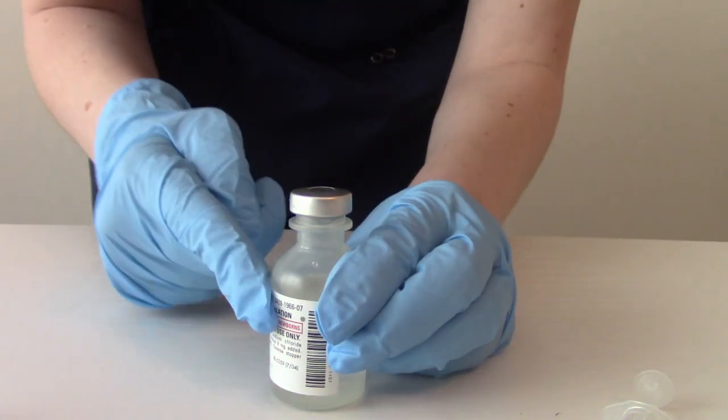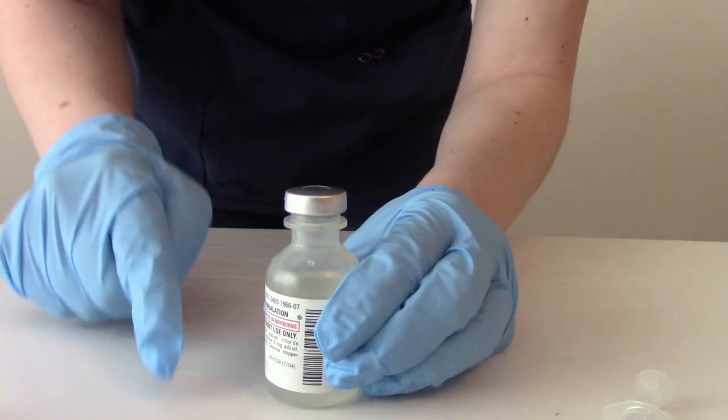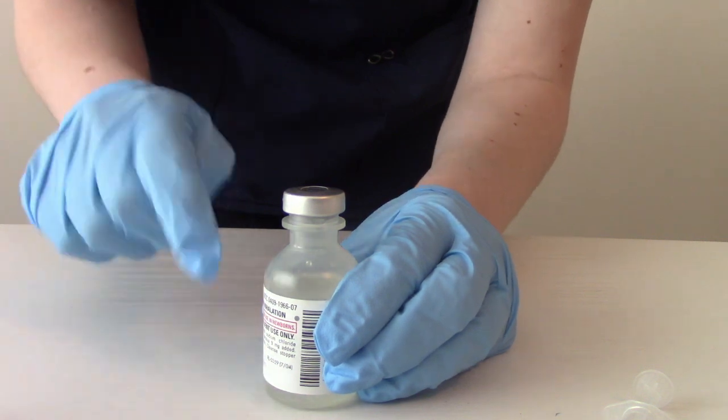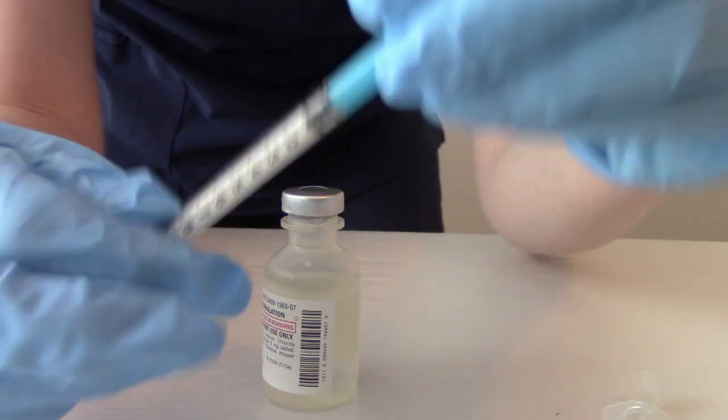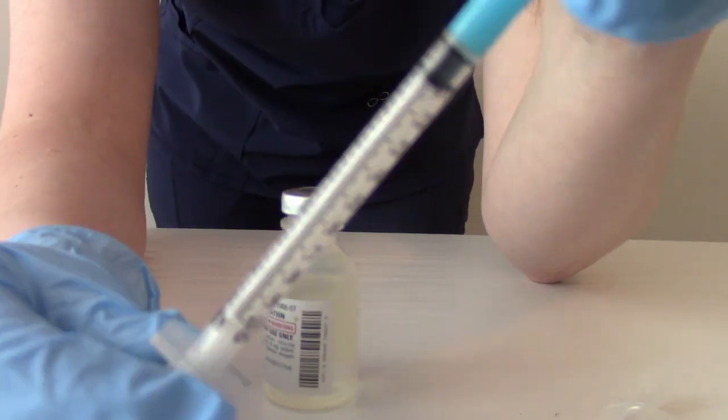Remember, when we're dealing with a vial, we have to check for expiration date, lot number, and manufacturer date. And the other little thing I wanted to point out first is this. This is a tuberculin syringe.